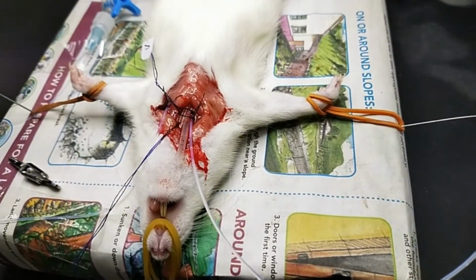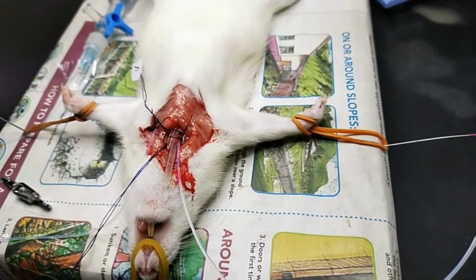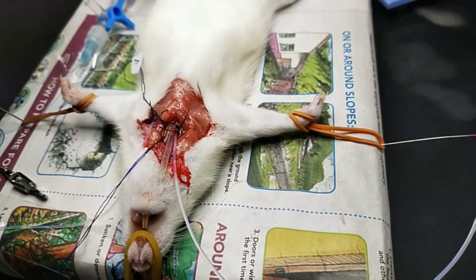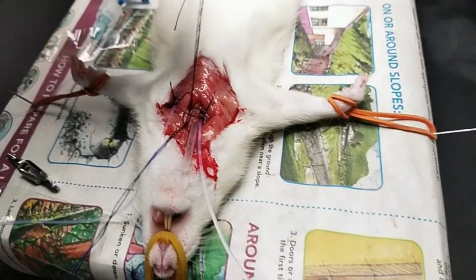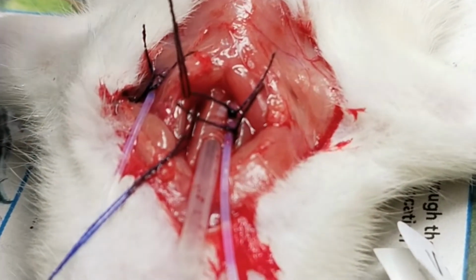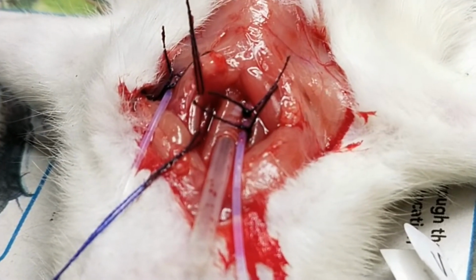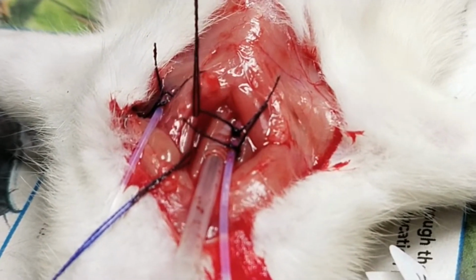So here is the setup for the animal preparation. We have several parts of the animal. First we have the vagus nerve, which is used for the electrical stimulation. We are going to stimulate the vagus nerve and see the effect on the blood pressure.